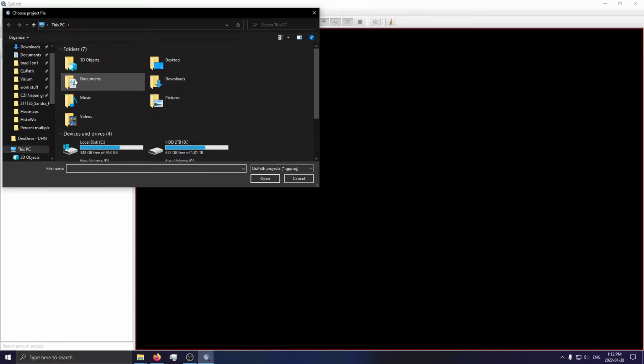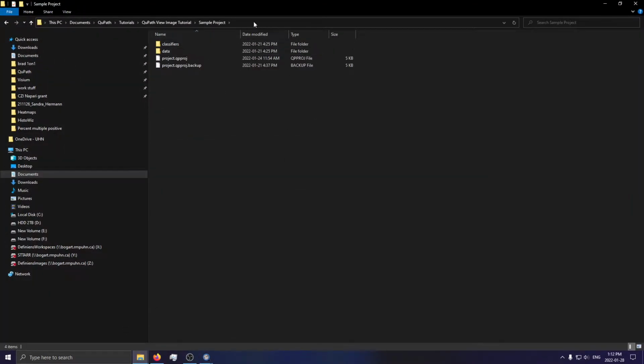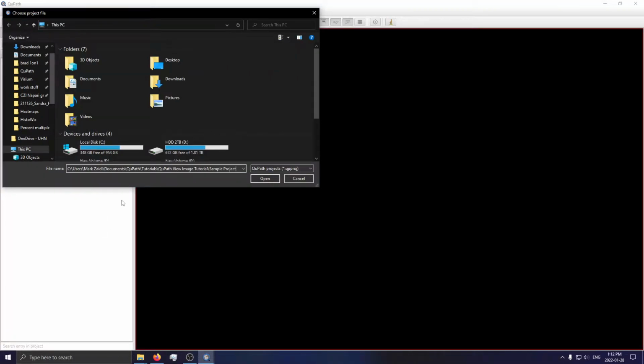But if that's needed, feel free to send me an email at mark@histwiz.com and I will send you a copy of the video. All right, so let's begin. First thing we want to do is to locate and open our QuPath project. It's located right here.